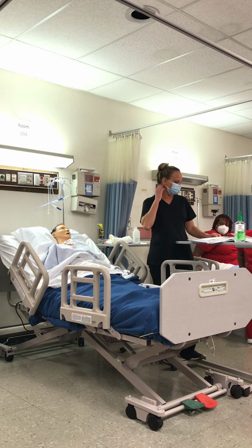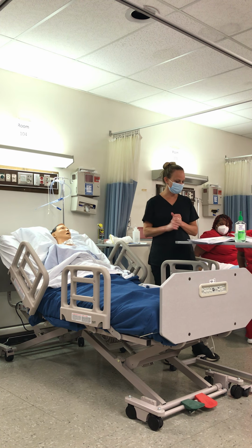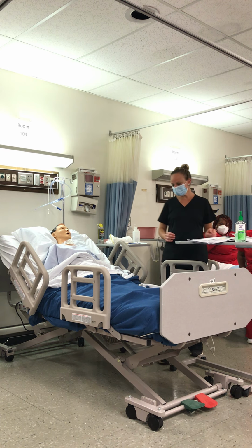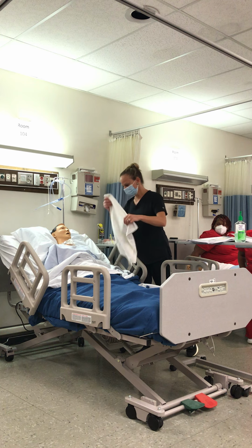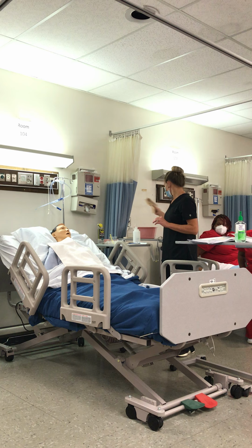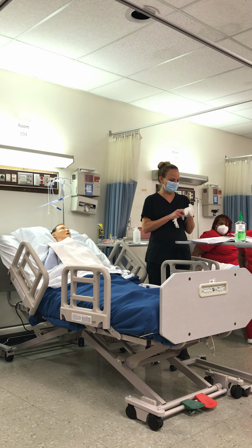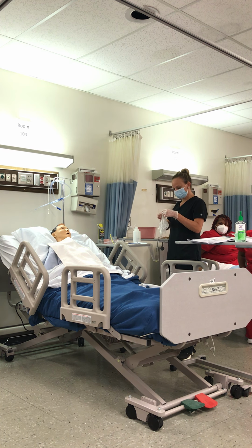Any questions so far? So I've already, I'm going to wash my hands. I've got them in the position that I want them in, because I put them in that position when I looked into their nose, okay? And then we're going to be getting ready for placing this tube, okay? So we want to put this here to protect. I wash my hands. I do want to put my gloves on. And now, at this point, is when I personally want to measure.